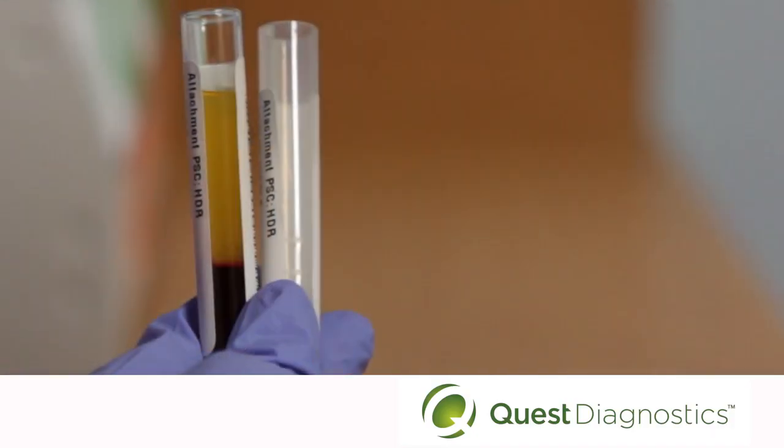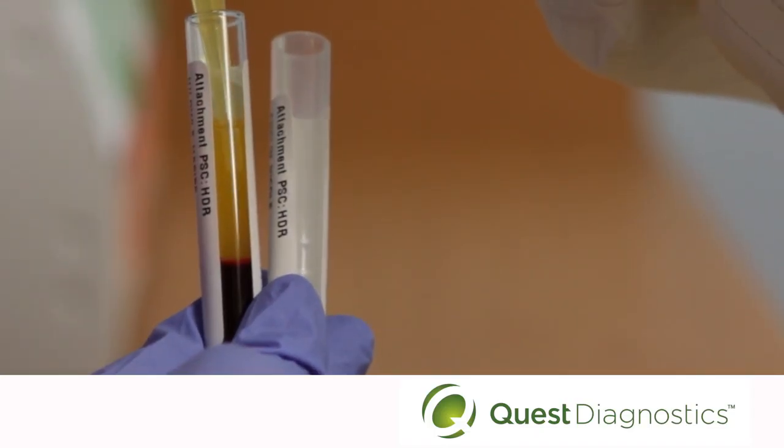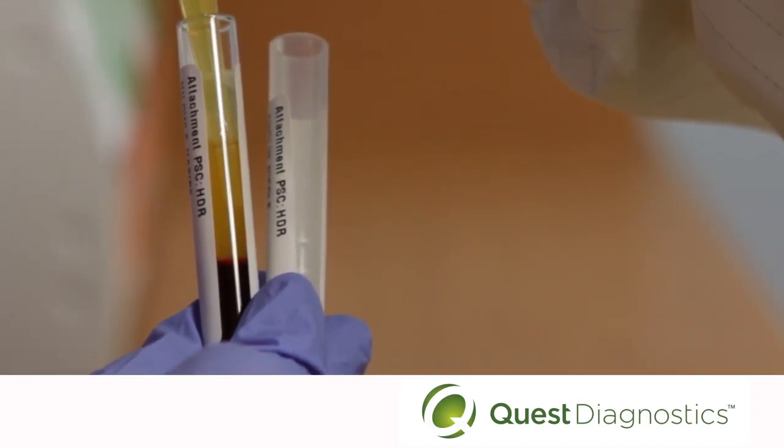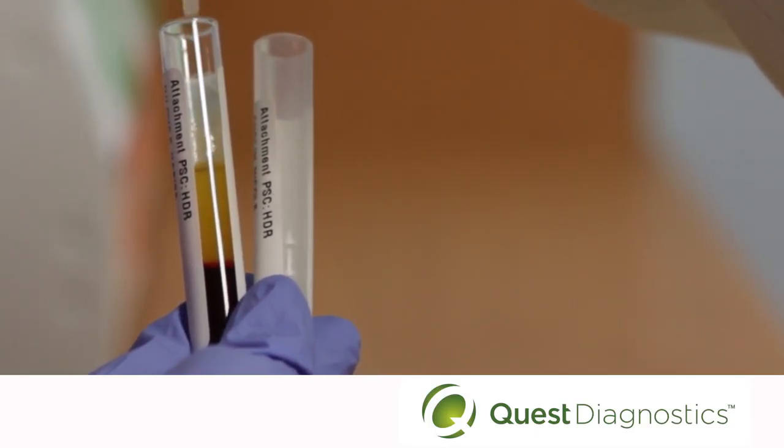To remove the plasma, start with the top and very gently draw the specimen up into the pipette as you move the pipette further down into the tube. Leave about one half milliliter of plasma.